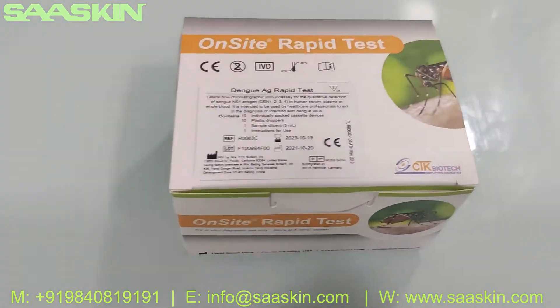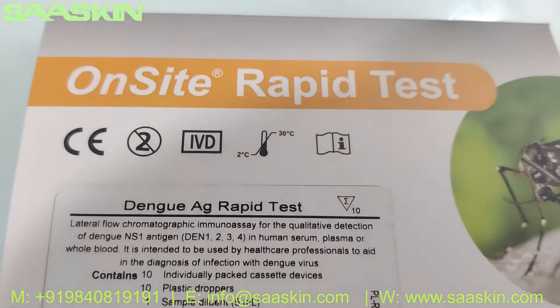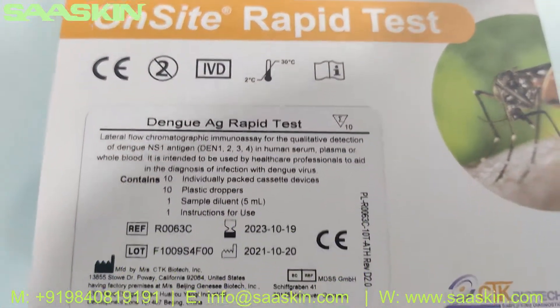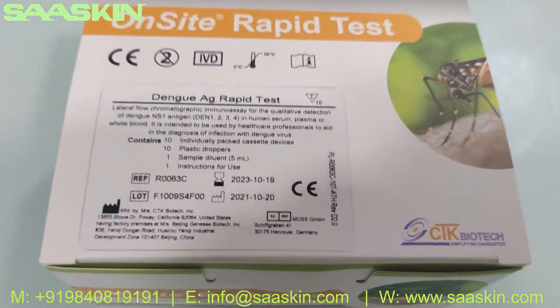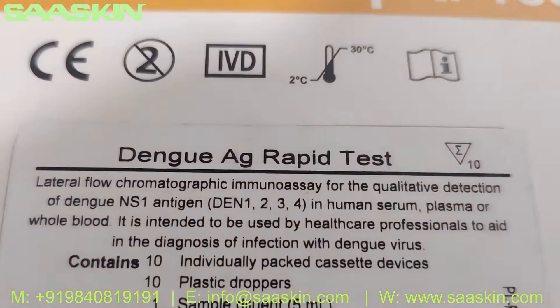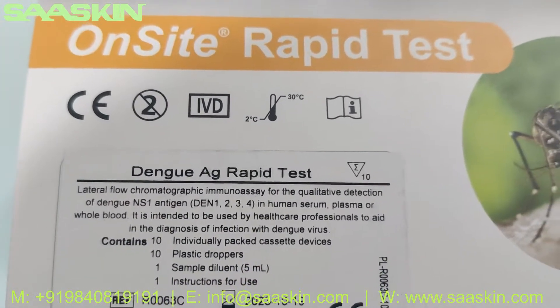Hello everybody, today we are going to see the unboxing of CTK Biotech on-site rabbit test for Dengue antigen — the rabbit test kit. It is a 10 test kit box, basically it is a CE IVD certified product. It is an on-site Dengue antigen rabbit test kit.